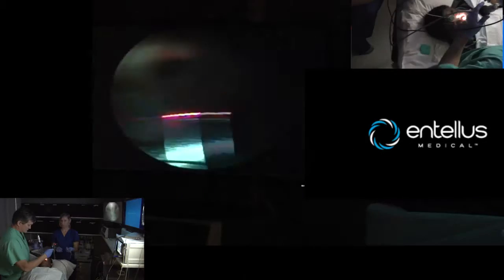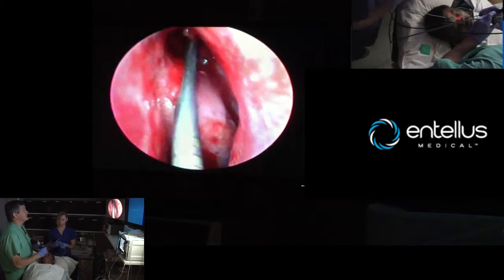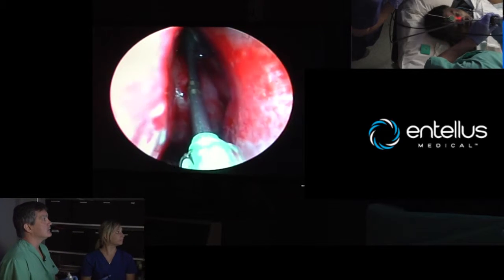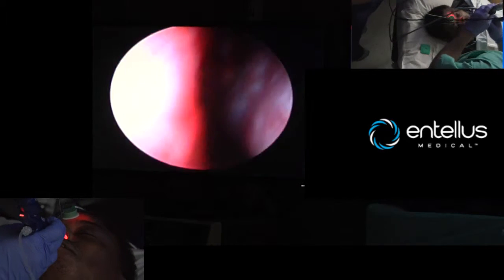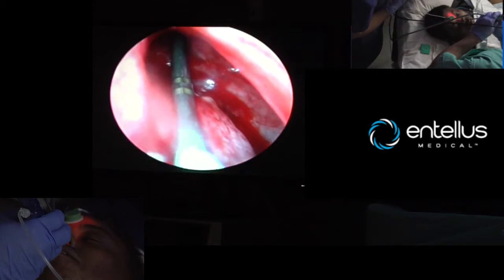When you're using the Ultra, the things to look for if you're new to balloons: you want to look for tactile feel and depth. If you look, there's our two centimeter mark. Then transillumination — we're going to go widely, it's clearly evident where we're at. If you look at two centimeters, there's the two centimeter mark right there.